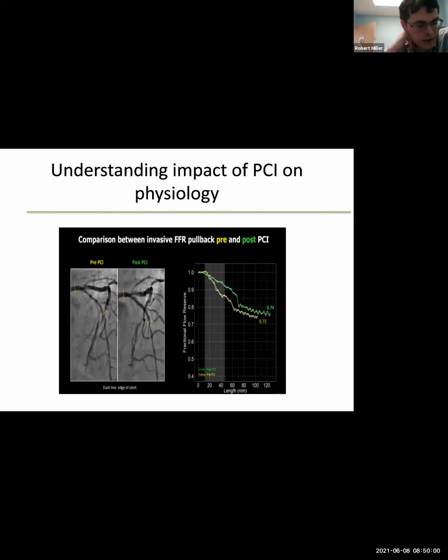Yeah, no, I think that's really helpful. I'm just going to break down one of the questions from one of the fellows. The background is the cardiologist here is still using a 64 slice cardiac CT scanner. So his question is, is there a cutoff for calcium where you proceed with the CCTA versus just doing a calcium score only? And would you have a cutoff if you were using a 64 slice scanner instead of, I think you're using a Revolution, right?